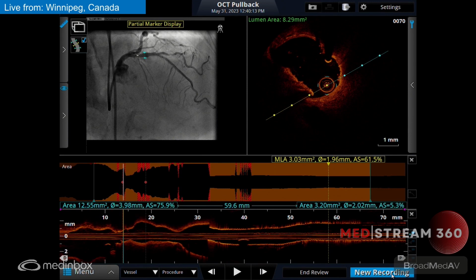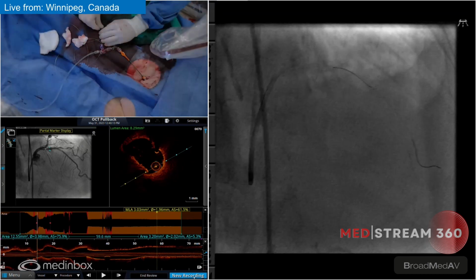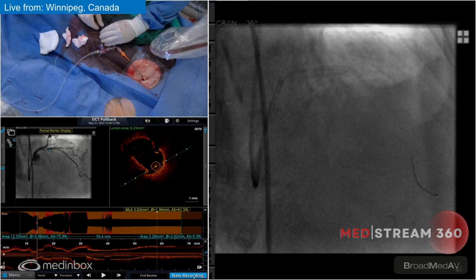15 or so. All right, Sheila, I'll give you this back here, please. That looks good to me. Great. Get the wire as deep as possible. I think we're done with the rota. What do you guys think? We're not going to go too much bigger than that.